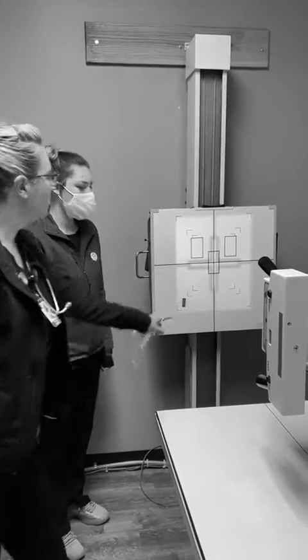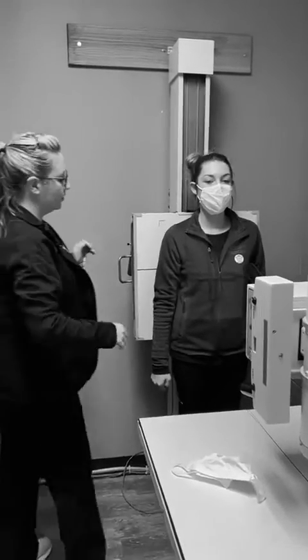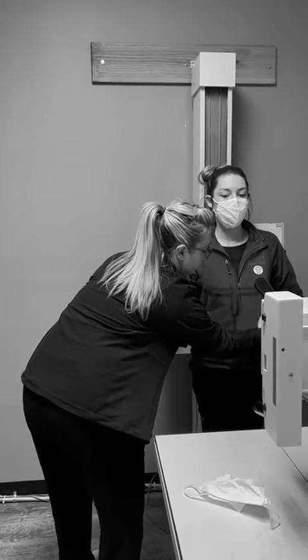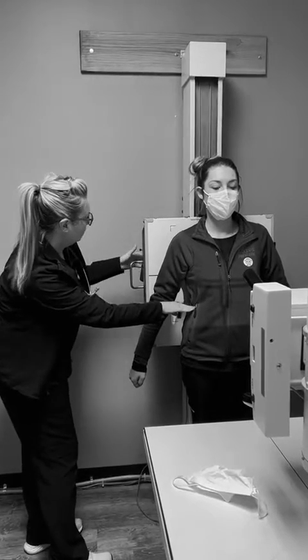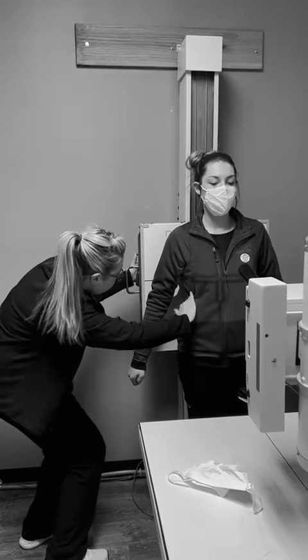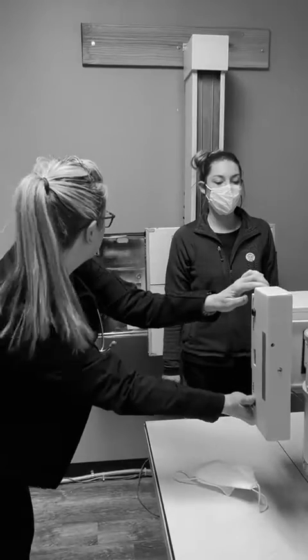This is the right of the patient. So I'm going to go ahead and put your back up against the board there. What we're going to do is find the crests — the top of the hips here. I'm going to press on you, and please do press on your patients; you've got to touch your patients sometimes. You need a little bit of finger width above the crest, about two to three finger widths above the crest there. Then realign everything and make sure it's all lined up.